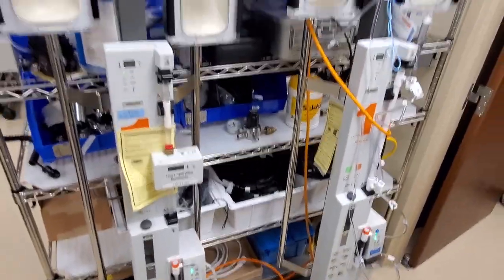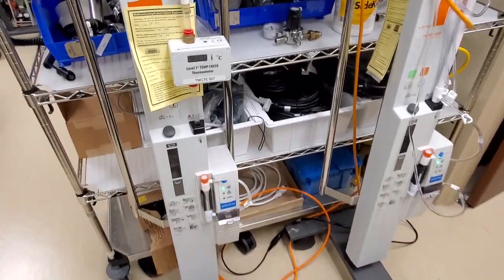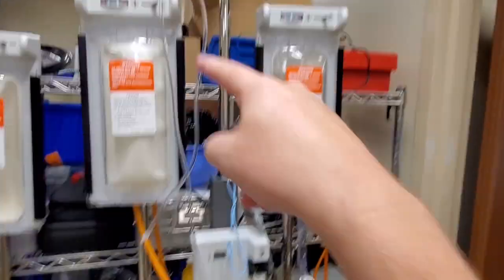Alright guys, here's the infamous level one rapid infusers. I know I've hit on them before. You can see this one here is set up as they would use it. They have the saline bag in there, the patient line.